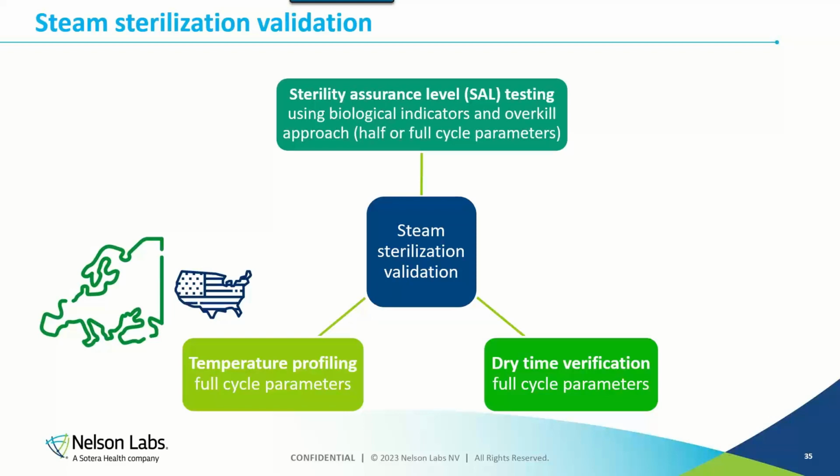And then temperature profiling is where we have a bit of a difference between markets. So for Europe, this is definitely required. It's definitely a must. You have to have the data. For the US, they sometimes will ask for it, but not always. And so we have seen customers where FDA has asked for temperature profiling, but they will not necessarily want you to do anything with it. They just want you to show that you have the data. For Europe, we tend to look at whether the temperature can reach -0 degrees and +3 degrees of the cycle settings.